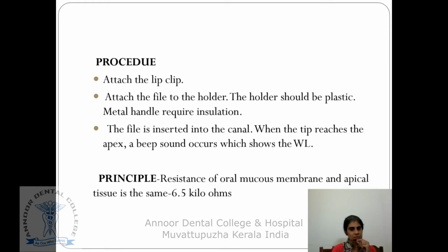The procedure is like this. You have a lip clip which is attached to the corner of the lip, and the file is attached to a holder. This holder should be plastic, as a metal handle will require insulation. Then the file is slowly inserted into the canal. When it reaches the apex, you will hear a beep sound. That shows you have reached the apical terminal point.